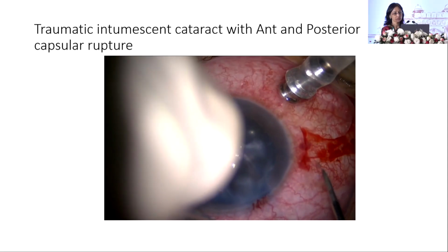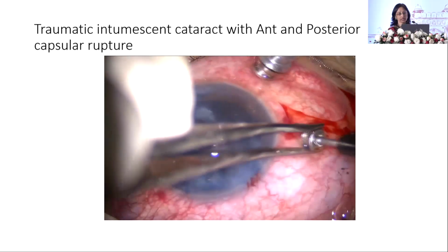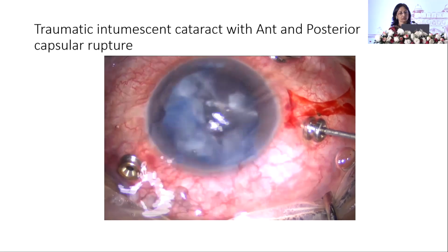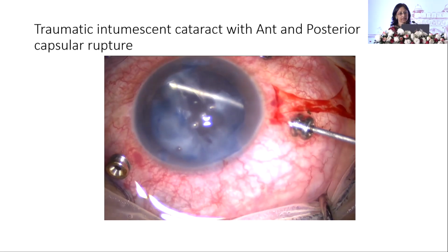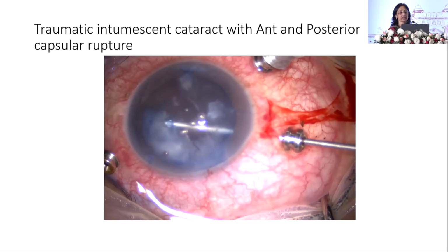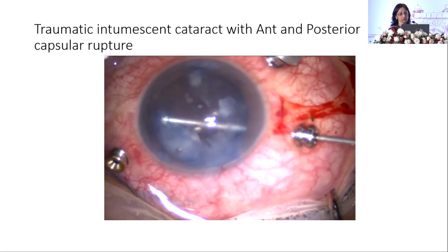So here we switch to the pars plana approach. As I have shown, it's very, very simple to put the trocar, and we introduce the cutter, and now my cutter is parallel to the plane of the iris. So I can move it all around without causing any traction on the sclera or indenting. It's just simple movement of the vitreous cutter, and here I'm switching between the cutting and only aspiration positions just by changing the foot switch position.